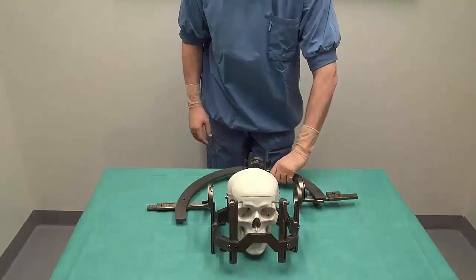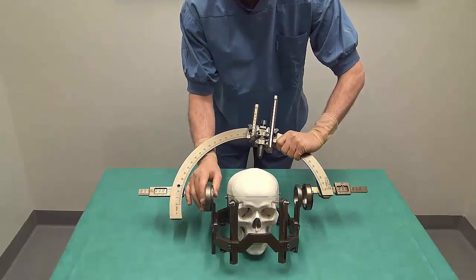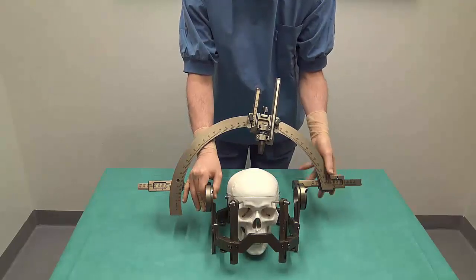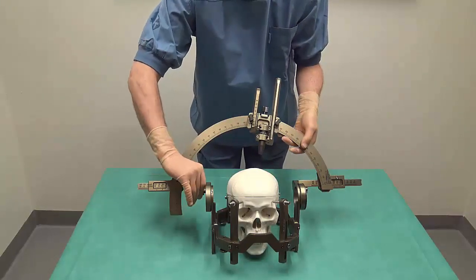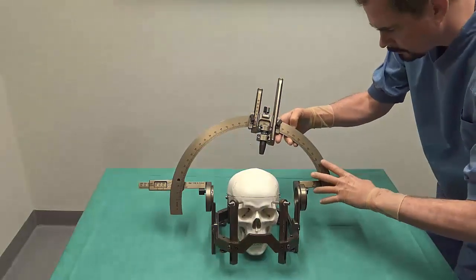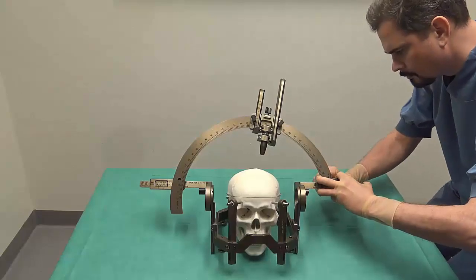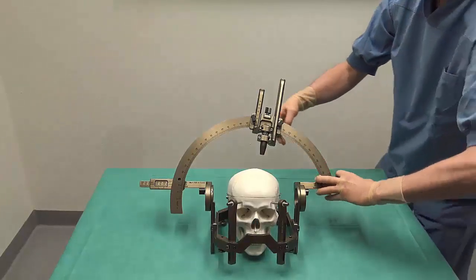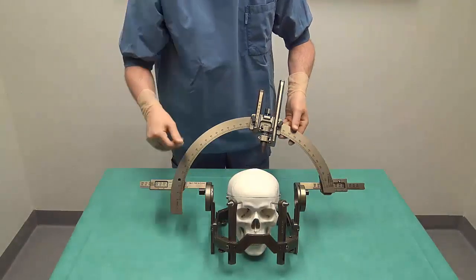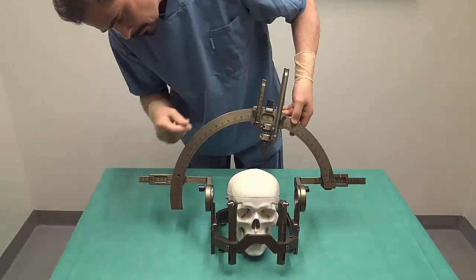Take the arc in your right hand and place the coordinate setting axis into the arc support on the right side. With your left hand, place the counter scale axis into the arc support on the left side. Press the counter scale axis into the arc support on the left side, making sure that you are pressing straight forward, and lock the counter scale axis.